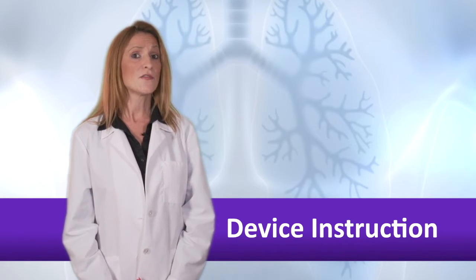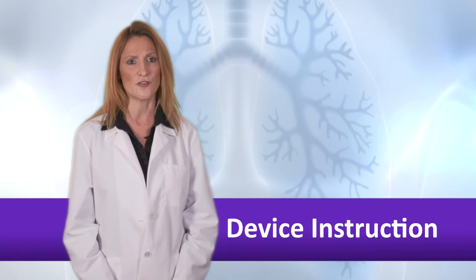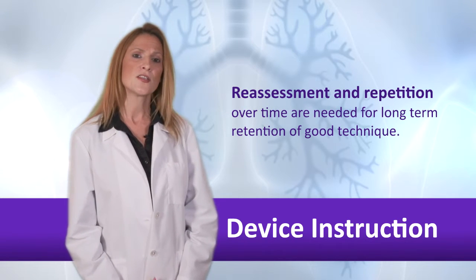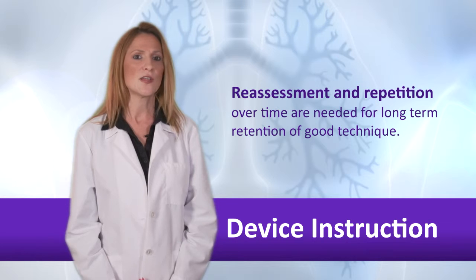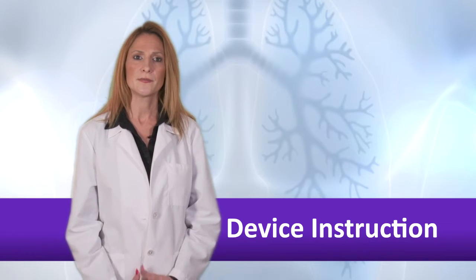In one study, up to 50% of patients performing device technique correctly at the end of initial instruction had inadequate technique as little as 1 month later. Reassessment and repetition are necessary for correct device technique to become habitual and sustained. Even patients who demonstrate excellent technique on initial instruction require follow-up.